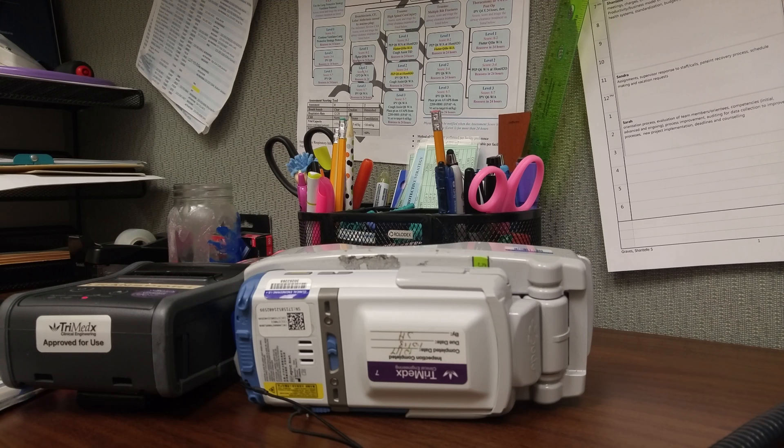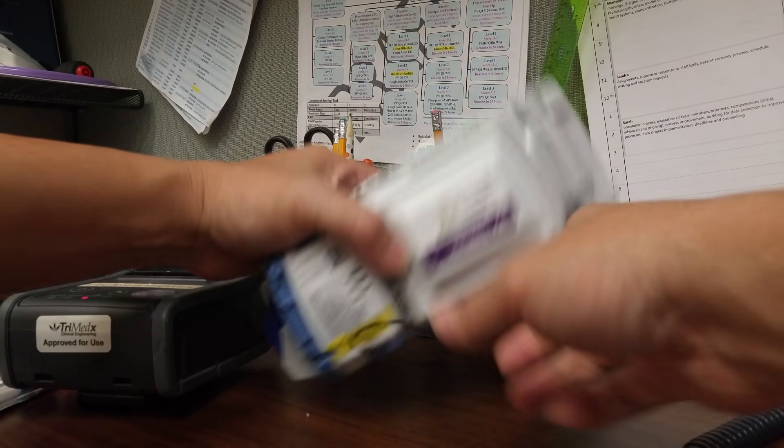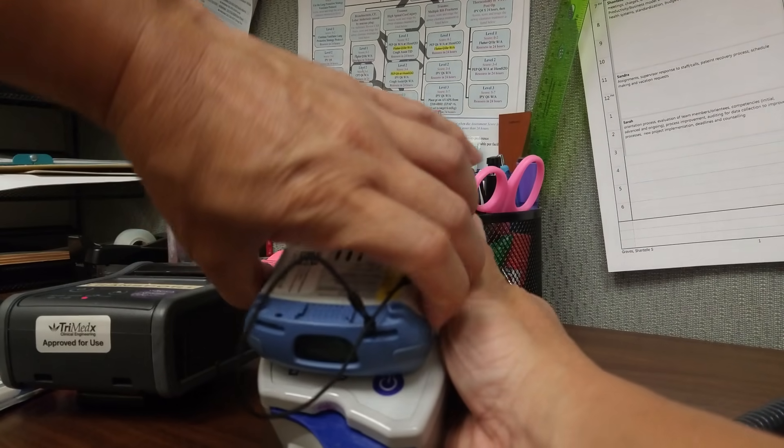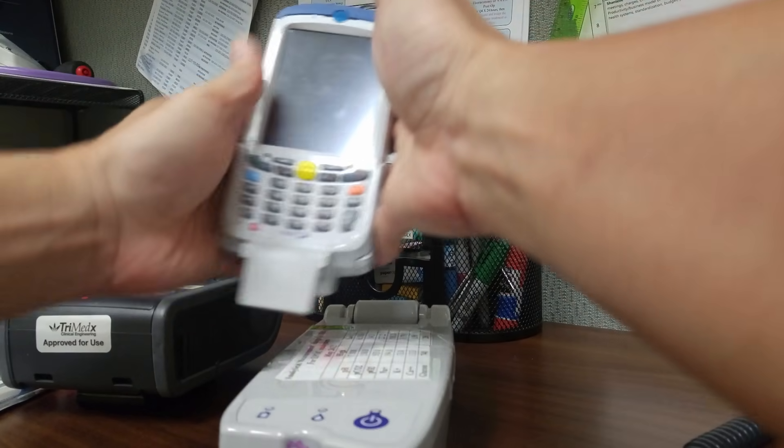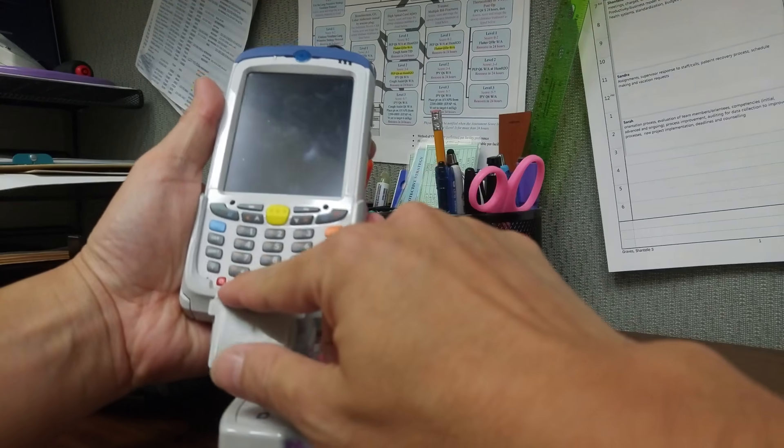All right, let's talk about the EPOC and how to use it to run a gas. This is the EPOC machine itself. You have to flip it open. The monitor comes off the base. There's a red on button.